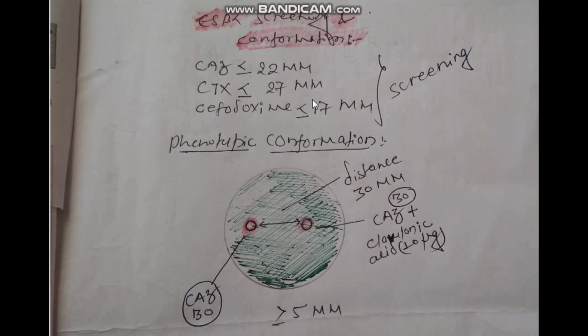In this way we can screen ESBL, but it can be phenotypically confirmed by this way.